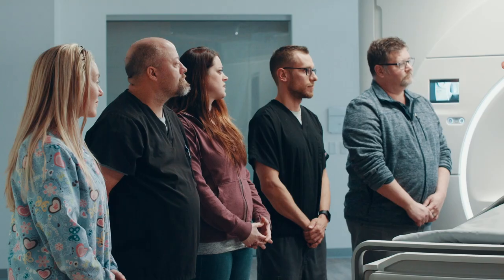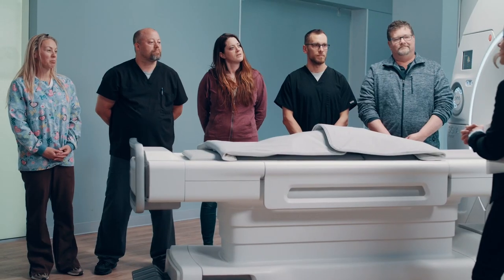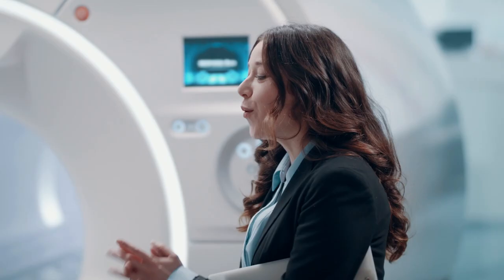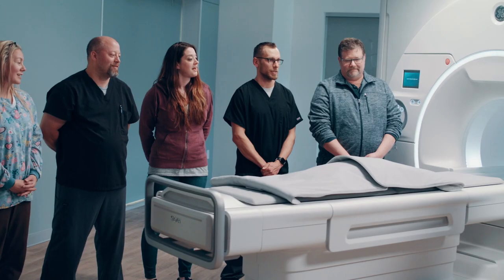What are your thoughts on the conventional coils — advantages, disadvantages? It's simple, simple use. Some don't fit or work well with certain patients. How might you change the coils for the better? Make them bigger. Lighter. A little more flexibility, maybe.